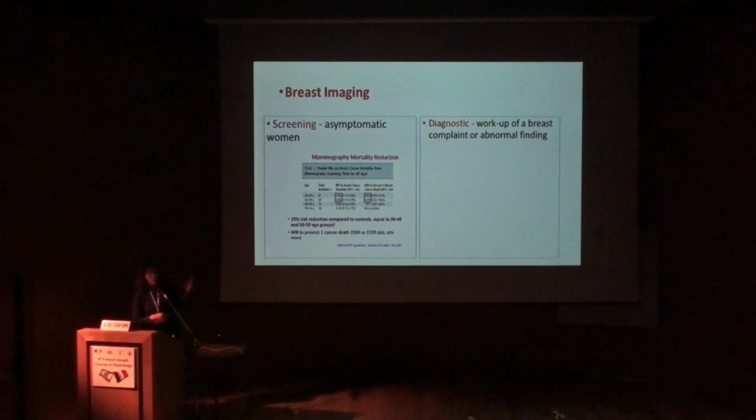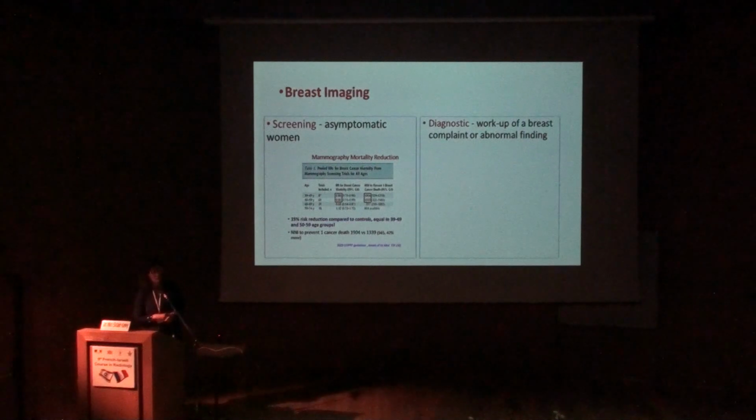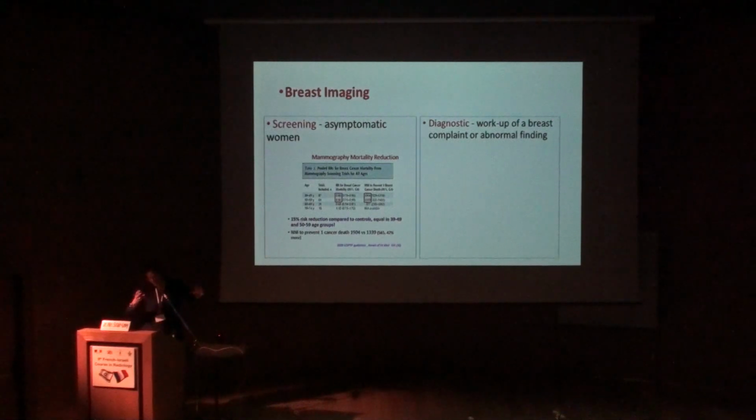This is, for example, a slide to show you that it is not that mammography does not detect breast cancer even at the age of 40 to 50, but the difference is in the amount of examination or mammography studies that we have to do in order to diagnose the breast cancer. So I think that the debate will not stop, but the policy will change with time.